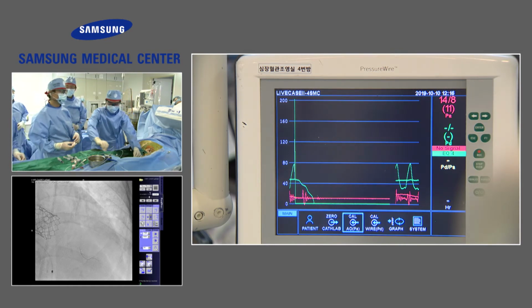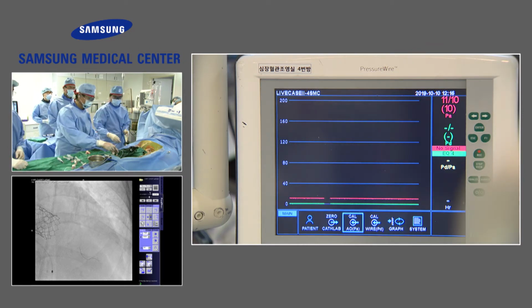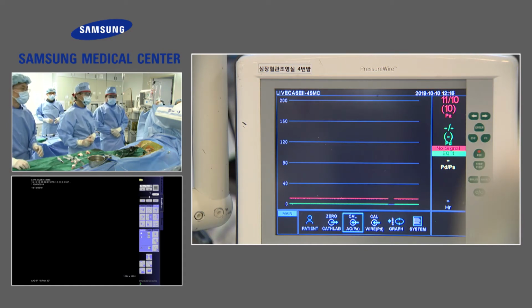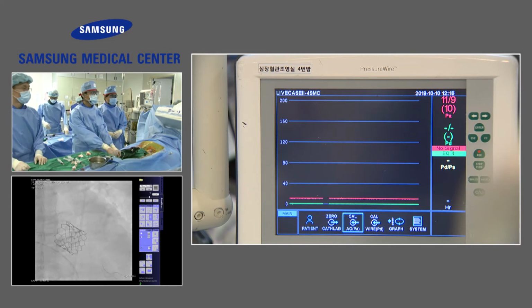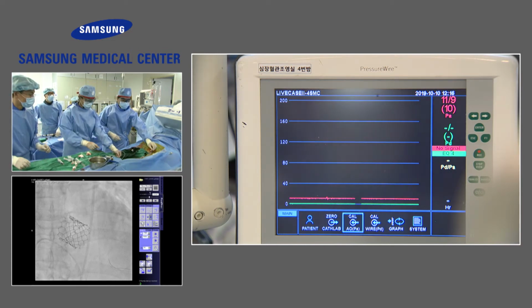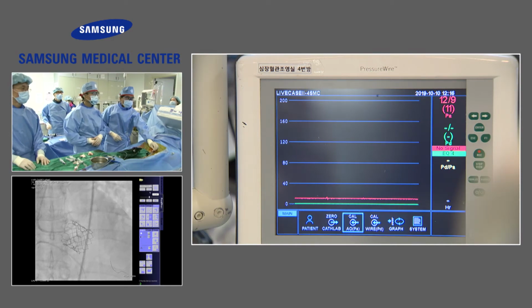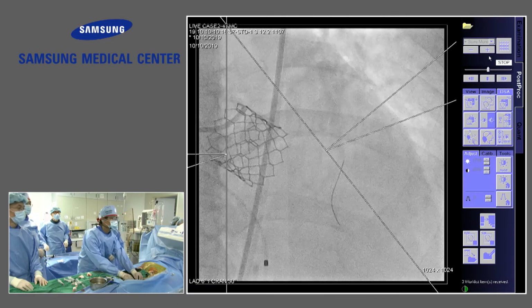Just as long as you're going to do it as boring as the TAVI procedure. Right. All right, don't try to make it exciting. No CT required, I guess. It's quite interesting that the afterload is reduced immediately after TAVI procedure. That increases FFR. The coronary flow is increased.